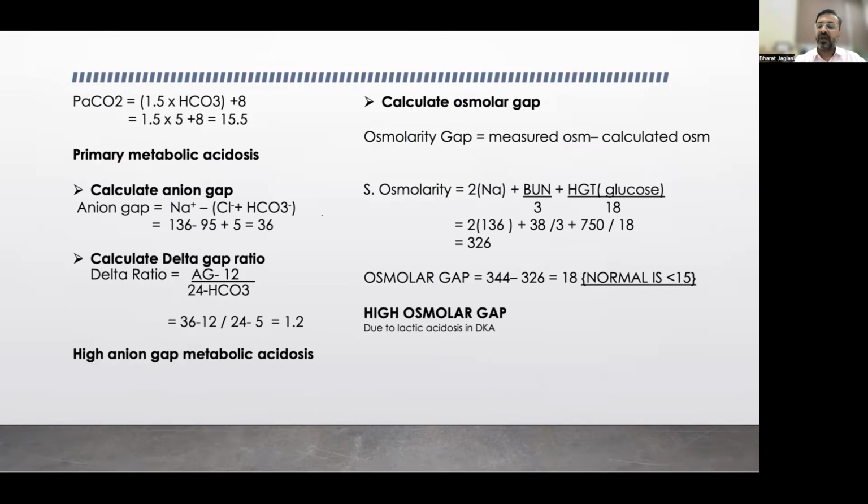So this is how a single ABG not only gives you the numbers and the physiological status of the patient, it also helps you in giving the diagnosis pertaining to the history of the patient. It's a very simple way of coming to the conclusion of this whole story. ABG tells the story of how the body fights to maintain balance. Our task is to read that story with clarity and empathy, and always correlate numbers with the patient at the bedside, because physiology, and not the printout, saves lives. Thank you very much.